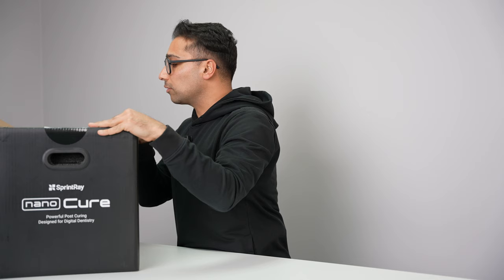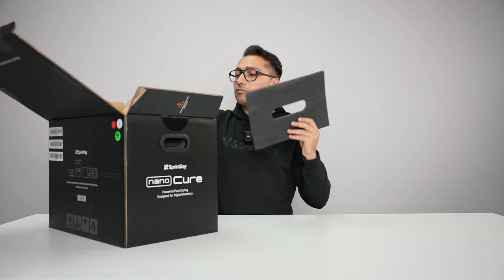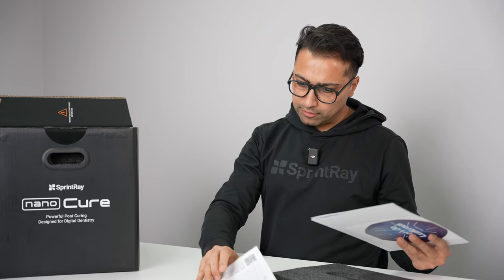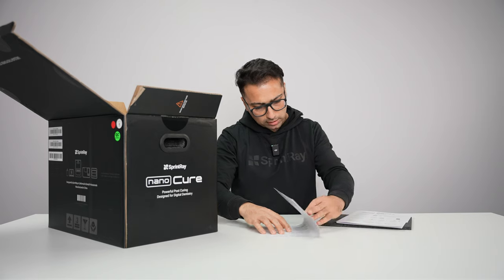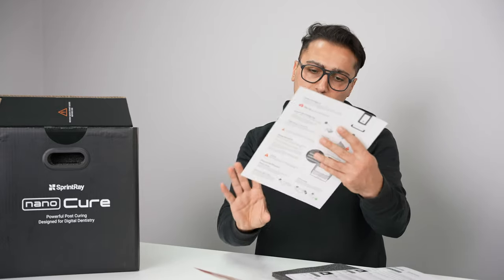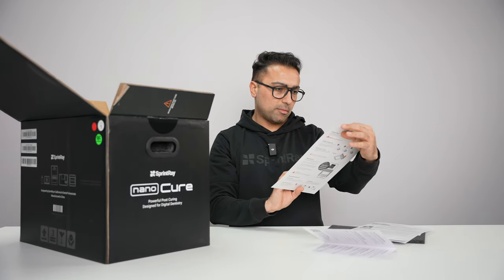Review the Quickstart Guide before use. Where is the Quickstart Guide? The first thing you see — remove this — then you're gonna get to the documentation. The welcome card talks about everything offered in terms of host sales support and educational programs. You're gonna find the NanoCure Quickstart Guide. It's very simple, very easy to figure out. Just a front and back.